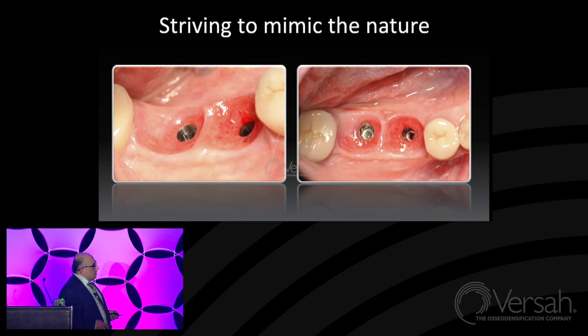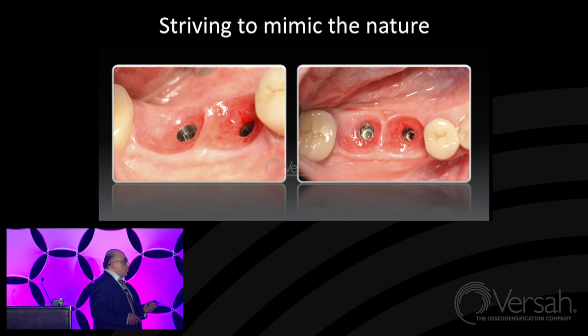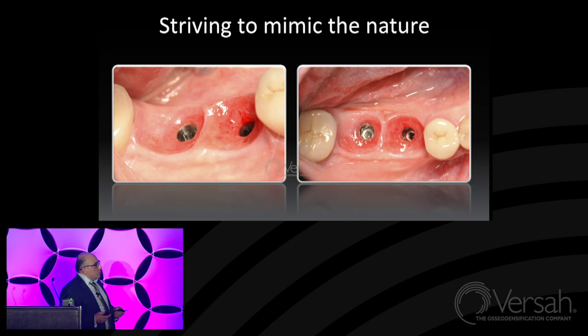And everything because we have a sufficient amount of soft tissue around the implants. If you have only 1.5 or 2 millimeters of soft tissue around implants, it's impossible to create such a type of emergence profile and to mimic nature. So to have this opportunity, we have to be sure that we can create a sufficient amount of soft tissue before this procedure.